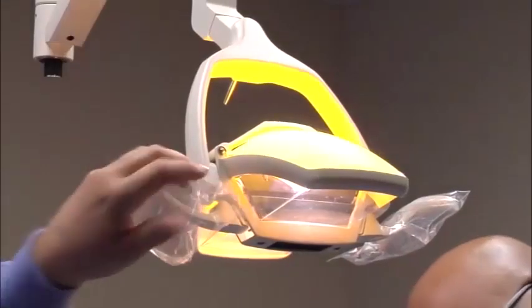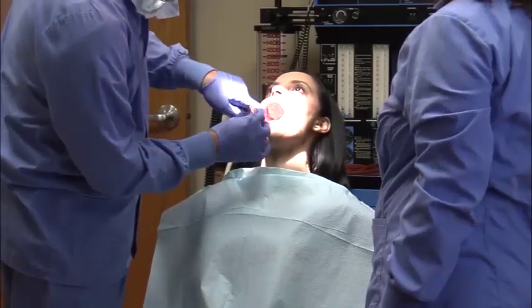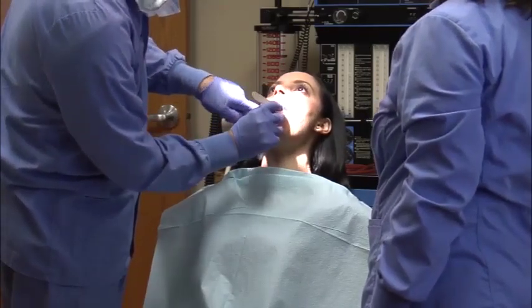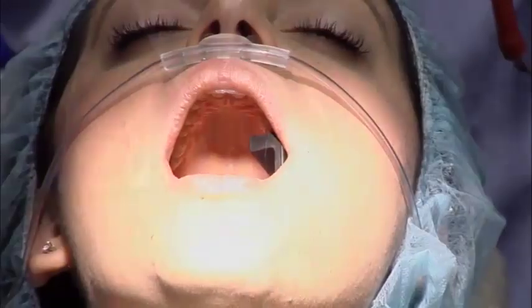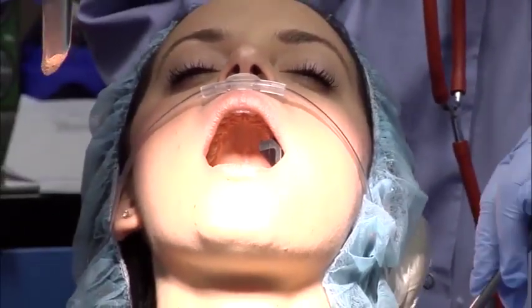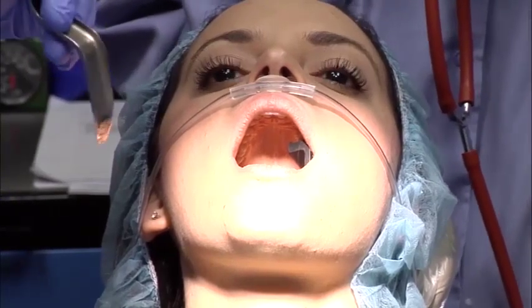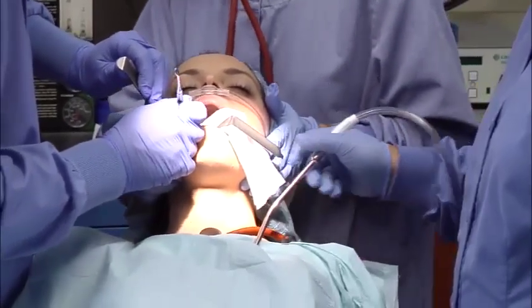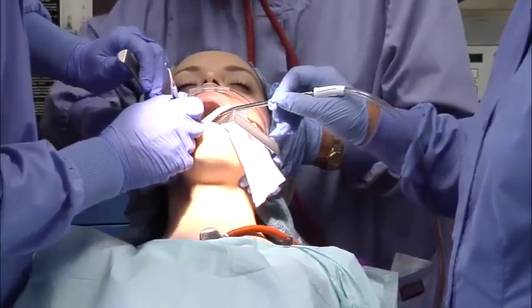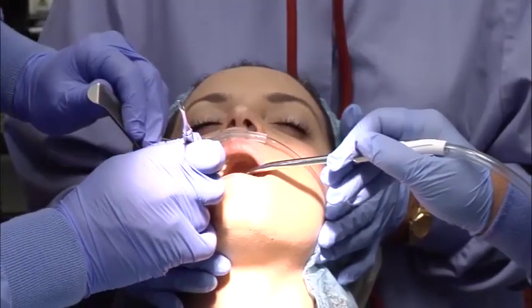The operating room lights must provide excellent visualization of the surgical field, while the room lighting should provide appropriate visualization of the entire patient during anesthesia delivery. In the event of a power failure, a battery-powered backup lighting system must be available. This system must be of sufficient intensity and duration to allow completion of the surgical procedure and safe delivery of anesthesia. Suction must be available during surgical treatment and anesthesia delivery. A central suction unit allowing appropriate evacuation and cleaning is preferred. A backup unit must be available should a power outage occur.